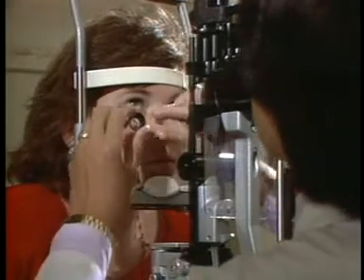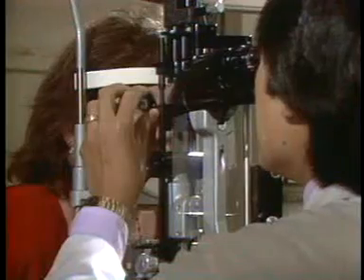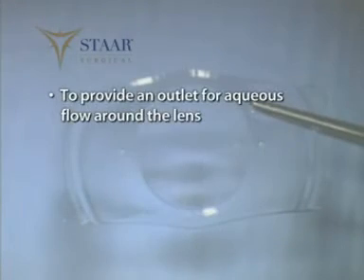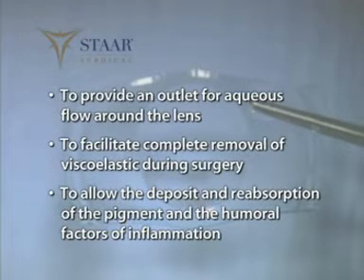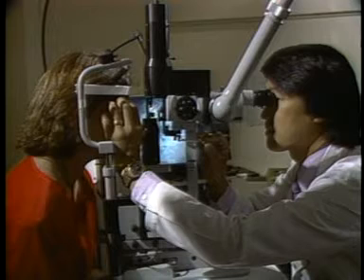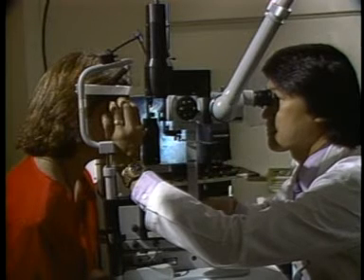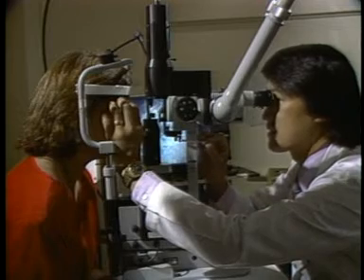One to 2 weeks before implantation, it is necessary to perform peripheral laser iridotomies, or PIs. PIs are necessary to provide an outlet for aqueous flow around the lens and to facilitate complete removal of viscoelastic during surgery. They are recommended 2 weeks prior to surgery to allow the deposit and reabsorption of the pigment and the humoral factors of inflammation. It is suggested to utilize an yttrium aluminum garnet or YAG laser, or a 2-step laser procedure by pre-treating with an argon laser followed by neodymium YAG PI.